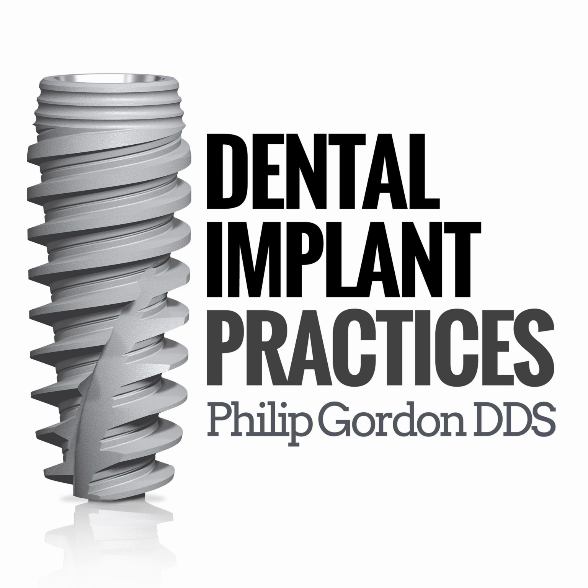Maybe they're just in regular dentures, because those are two different scenarios. They both might be able to be immediately temporized, but maybe the information you're getting beforehand or the surgeries are different. Maybe the types of surgical guides are different. Maybe one's tissue borne and one's bone borne. But let's walk through both of those scenarios.